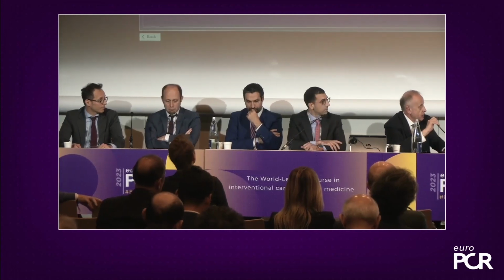Me, yes. If you can come closer to the microphone. Sorry. First, we have in the guidelines that we should use FFR in intermediate lesions to know whether to proceed to PCI or postpone the PCI and treat the patient medically. Second, we know that after angiographically guided PCI, in two-thirds of patients, FFR is not increasing up to 0.9, which does mean that it is not the optimal result. So we should use FFR again, with wire or microcatheter.